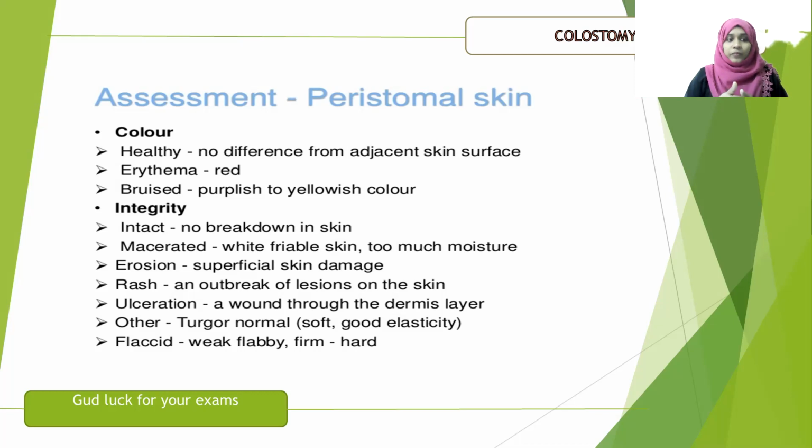Now, we will check for the turgor. If the turgor is good, there is good elasticity. Check for weak, flabby skin.